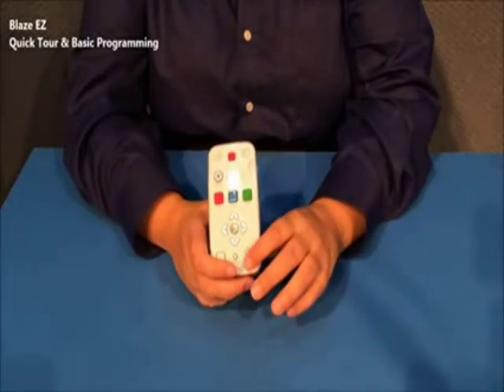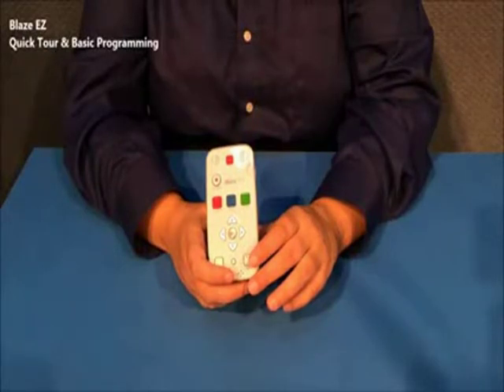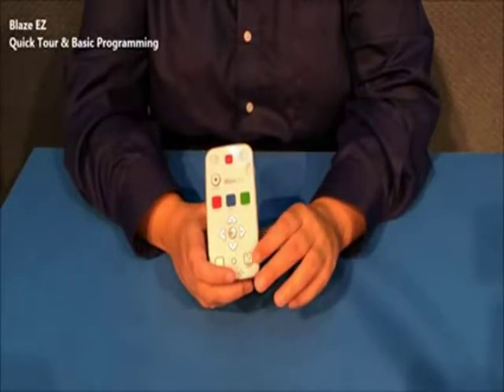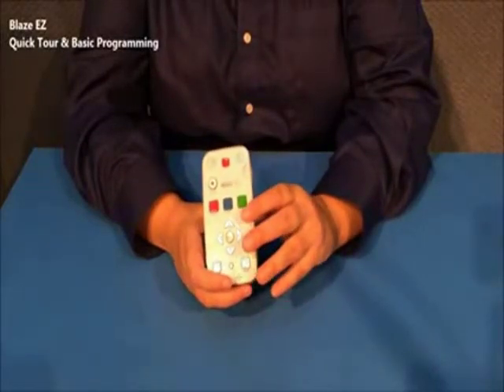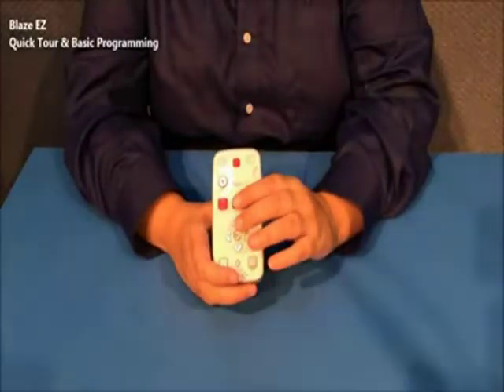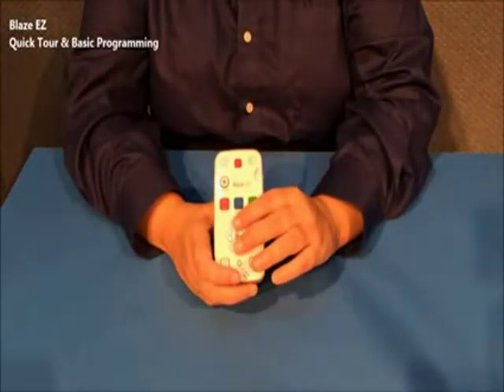The less labeled button here is the OCR button, and as I explained previously, we're going to go over that in more detail in the third video. However, I will press it now just to show you a little bit about what's here. Take a picture. The first item here is take a picture, which of course is most convenient because that's generally what you're going to want to do with this program.